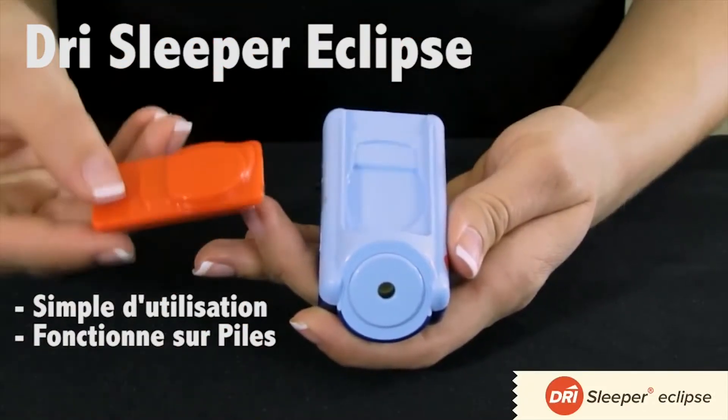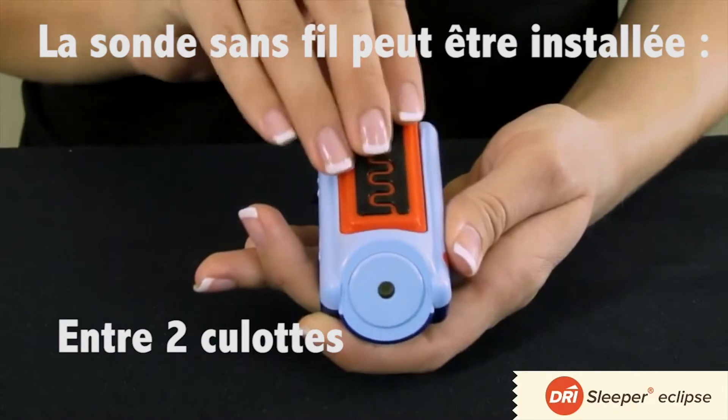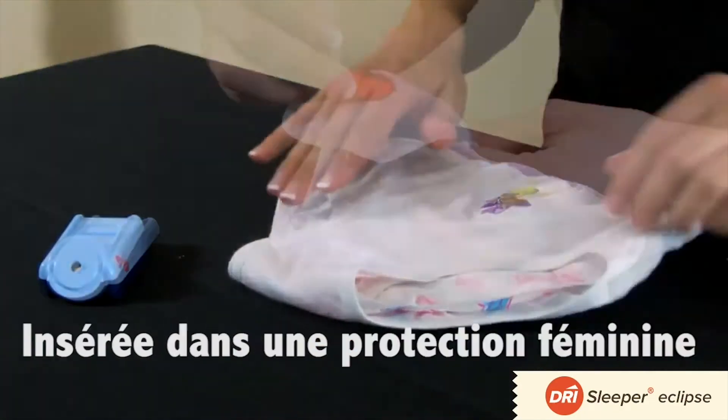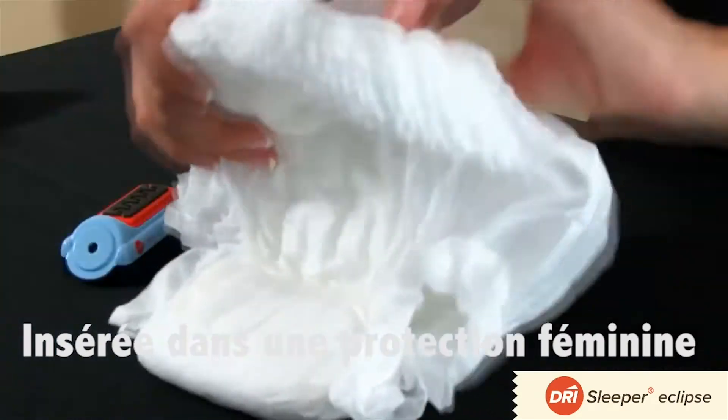The Dry Eclipse is an easy-to-use bedwetting alarm that works without wires. The Euro sensor can be used to sandwich between two pairs of underwear, with a mini pad, or a pull-up.